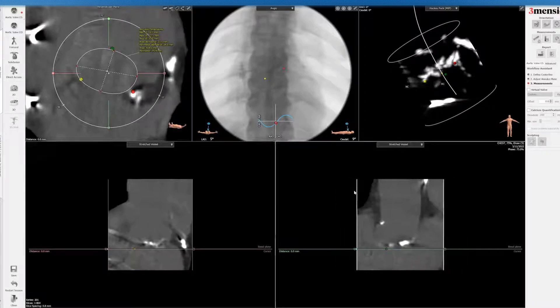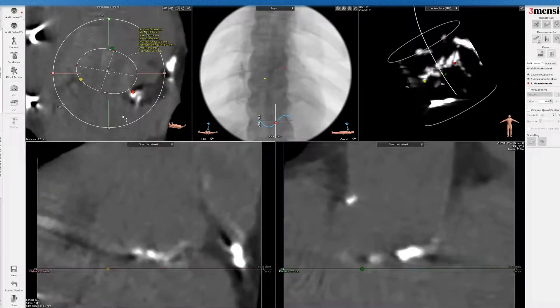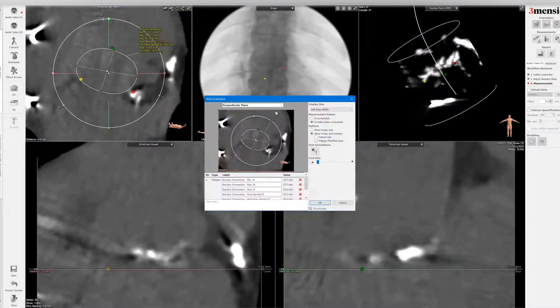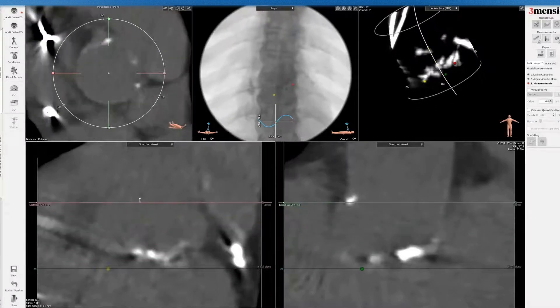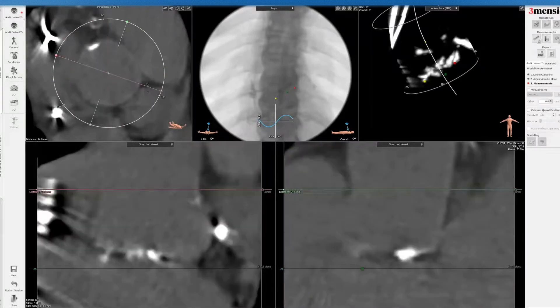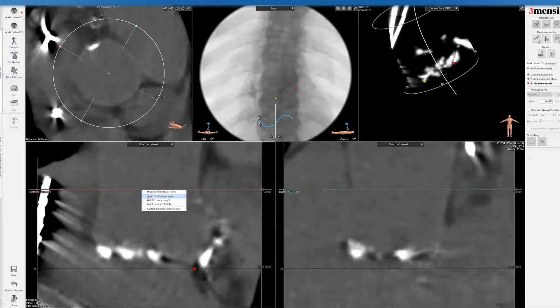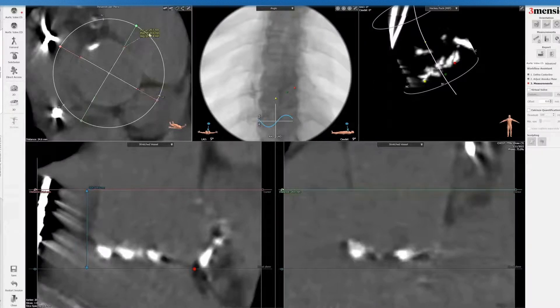That's also been my preference in patients with advanced CKD, where we also have to limit contrast during the procedure. I'm going to save this annulus. Obviously, we cannot do an LVOT assessment because there's no contrast in the LVOT, so I'll skip that. But you can now go to the aortic root to the STJ. Despite being a non-contrast scan, you can actually estimate the sinotubular junction right there and spin around to rotate. You can estimate the sinus of Valsalva height, and then measure the STJ with the ruler times two and label it as an STJ.